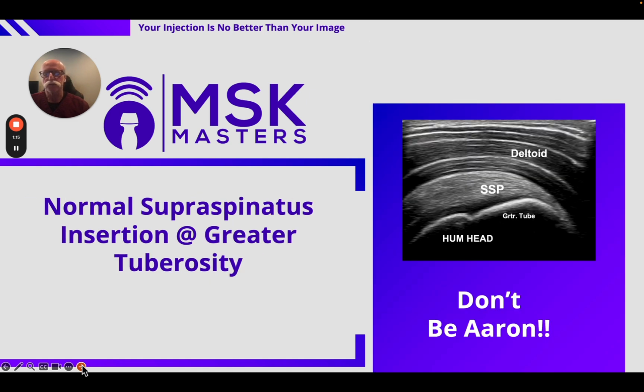curious finding here. So here you see a really beautiful hyperechoic fibrous architecture of the supraspinatus tendon inserting onto the greater tuberosity, a nice linear anechoic uniform thickness tendon footprint, anatomic neck on the humerus, humeral head, and then the anechoic interface here, that becomes hyaline cartilage. So don't confuse that footprint with hyaline cartilage. But this is really just a very pristine looking insertion of the supraspinatus on the greater tuberosity.